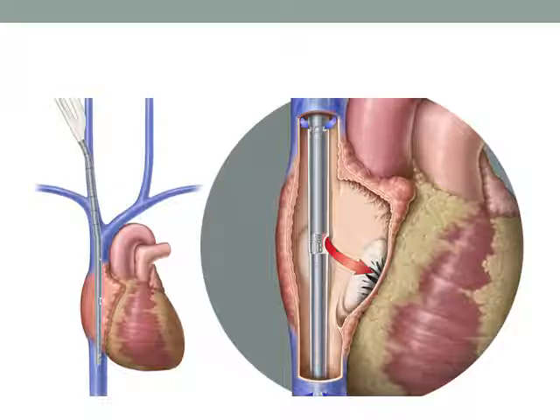And if your lungs don't work, it doesn't matter. That's what the ECMO is for. As the lungs start getting better, we need this less and less. Okay? So that's how VV ECMO works.